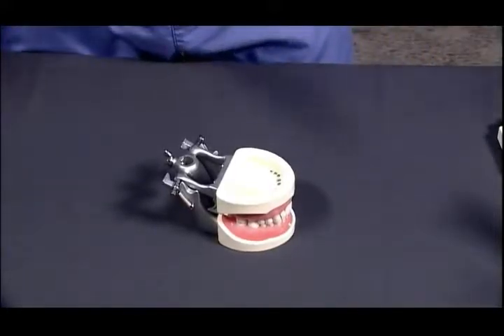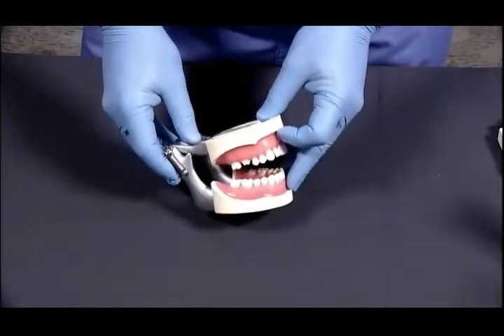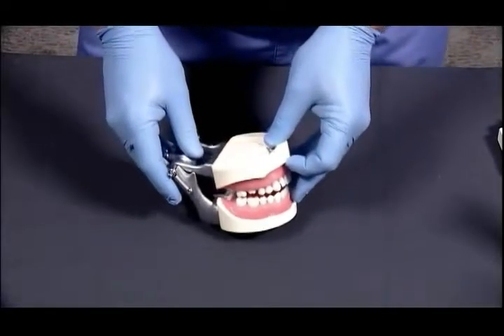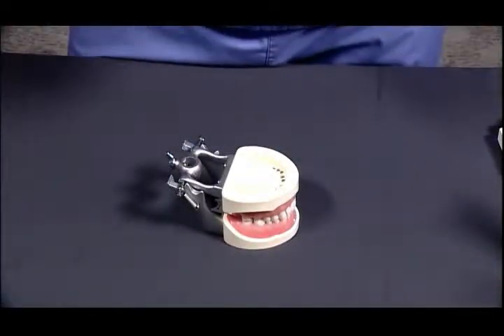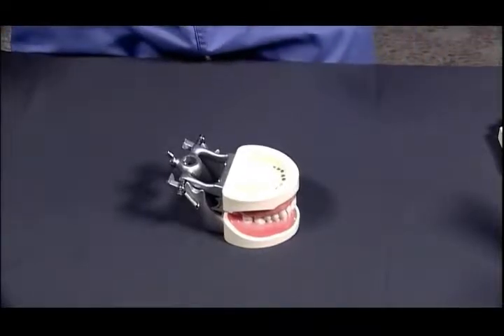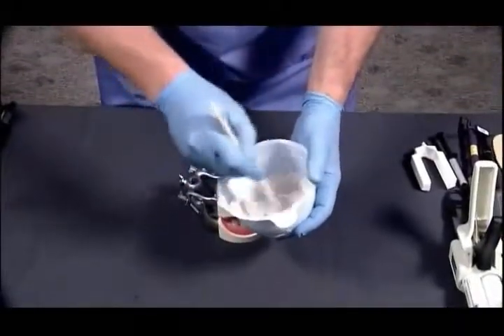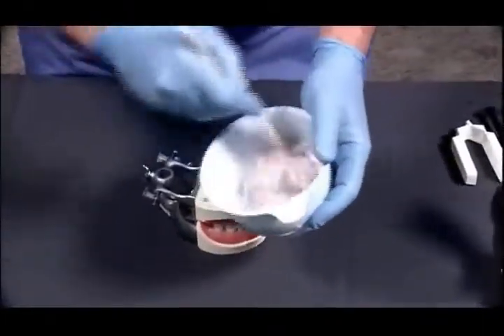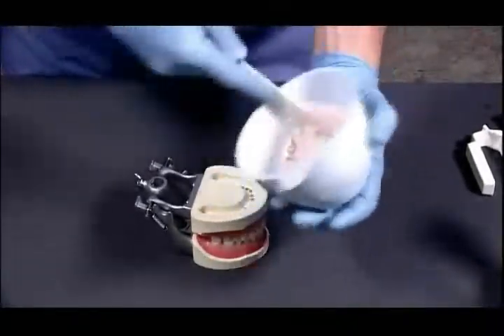Now, any good alginate will work in this situation. The demonstration we're using today, we're using a syringeable hydrocolloid, which is made by Dux Dental, and that syringeable hydrocolloid gives us much more detail in our final impression. So my assistant would mix up the alginate. The alginate is mixed appropriately, so your assistant is putting in the measured amounts of alginate and mixing to its best consistency for taking an impression.